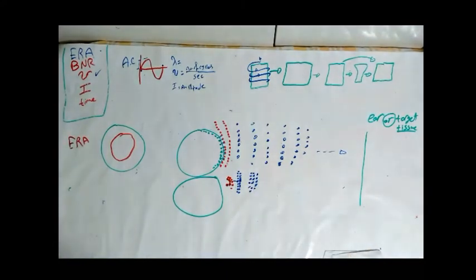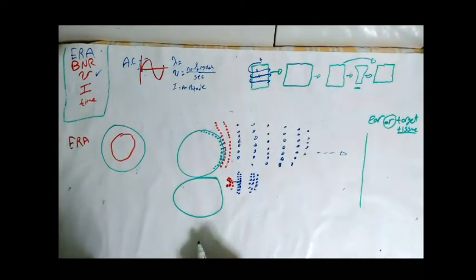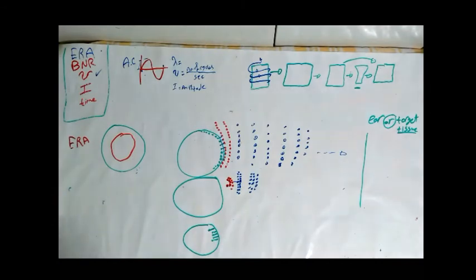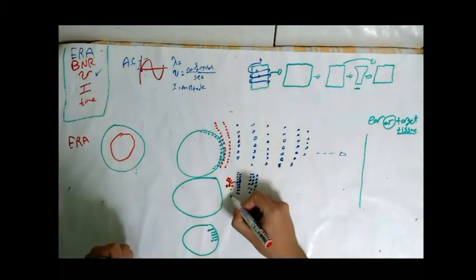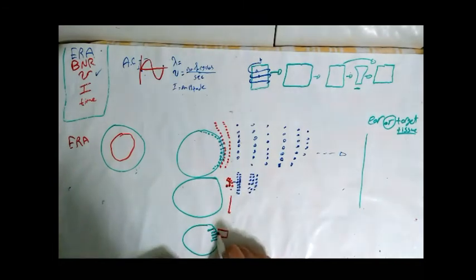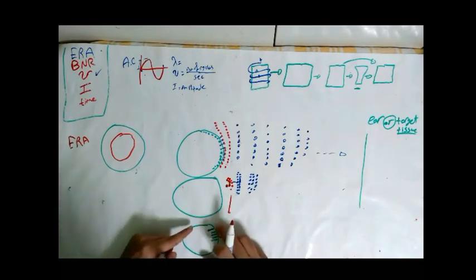When the crystal now shrinks, as the atoms move backward, you will notice that there is now a large distance between the atoms of the stainless steel and the crystal.